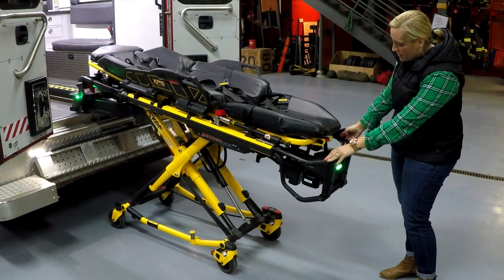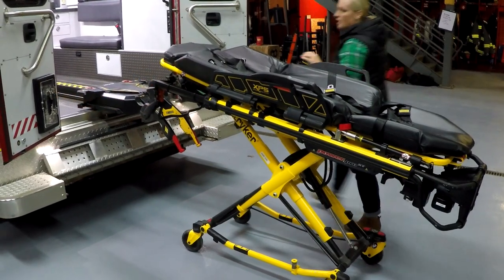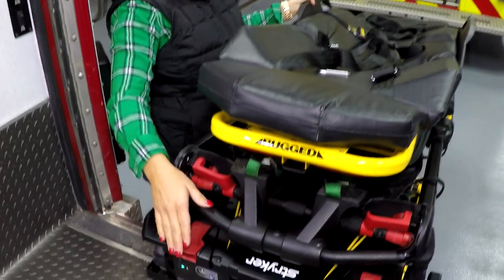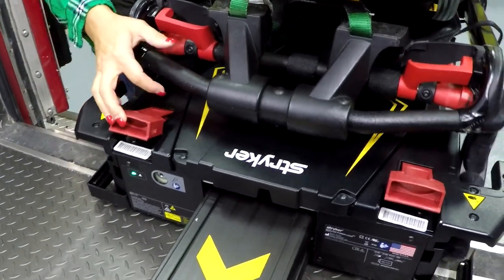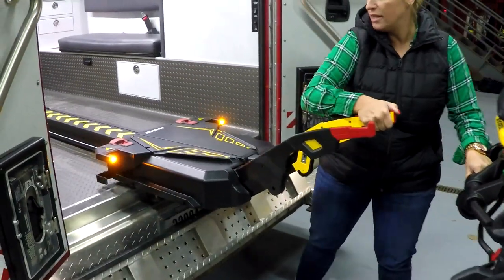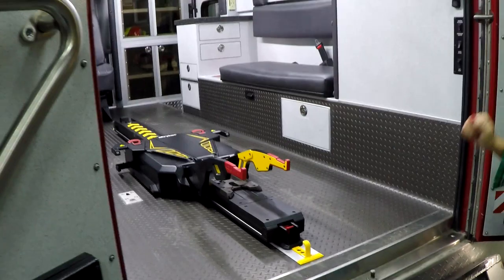Right above your plus and minus buttons there's a little red button — you can release the cot that way, or from back here. At this point the cot is still locked in. If there's a patient on the cot, we recommend using the red handles on either side to release. Then pull the cot straight out. Lift the red handles up and the trolley slides back in. Just make sure it's back far enough that you can close your ambulance doors.